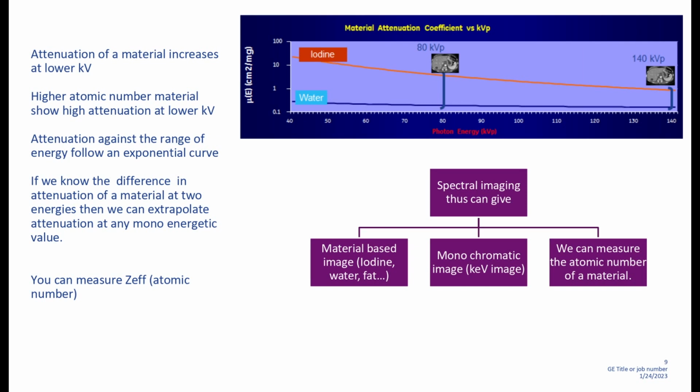And measure the ROI for the plain image. And for the contrast, make it 68 keV and measure the peak enhancement. We always go for the best enhancement. There is no standardization or any particular criteria, because this is by changing the keV. Changing keV will drastically change your enhancement values. That is where we go for this particular value called optimal CNR, optimal contrast noise ratio. Through experiments, whatever we have done, we know that at 65 to 68 keV you can actually visually see that. There are no known criteria for that.